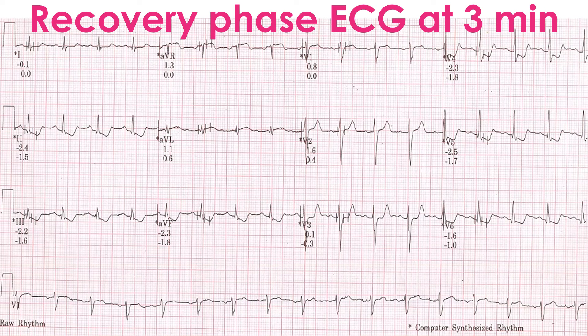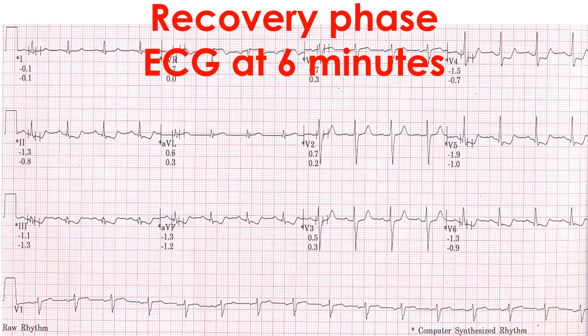ECG at 3 minutes of recovery shows further worsening of ST segment depression in inferior and lateral leads, establishing the presence of significant myocardial ischemia. The TMT recovery phase ECG at 6 minutes shows the persistence of down-sloping ST segment depression. This calls for further evaluation including coronary angiography and revascularization if feasible. ECG recording must be continued until the ST segment shift resolves.